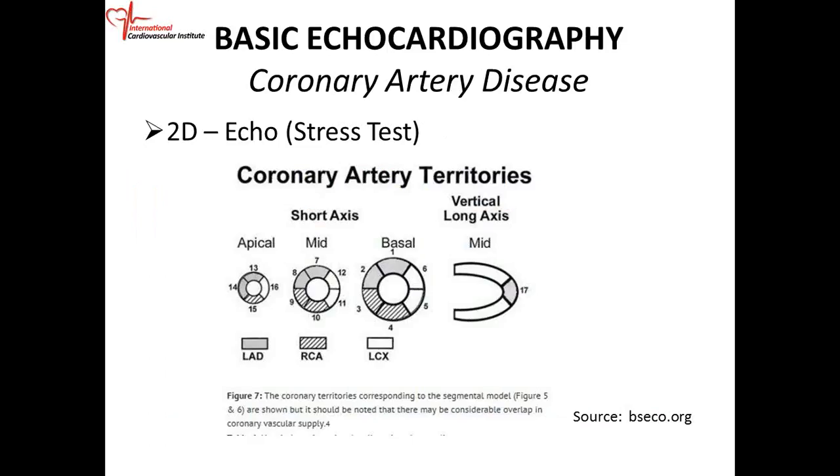So you're going to get vital signs before, you're going to get a brief history before, and then you hook the patient up, you get your baseline or resting ECG, you put them on the treadmill, and you let them walk. So if you're using the Bruce protocol, then every 3 minutes, you increase the speed and inclination. There are different types of protocol.